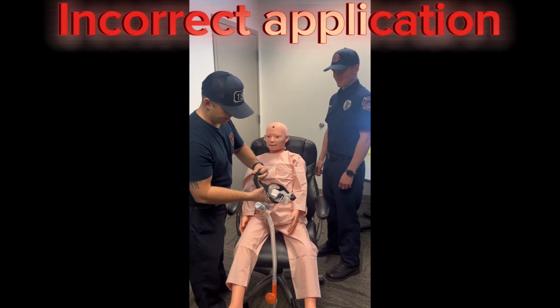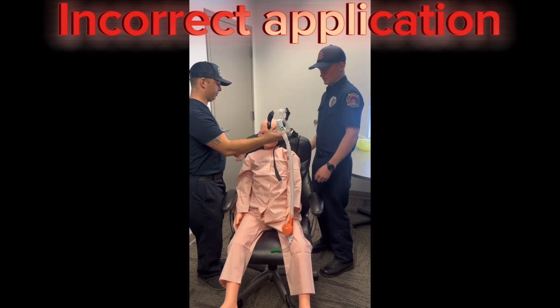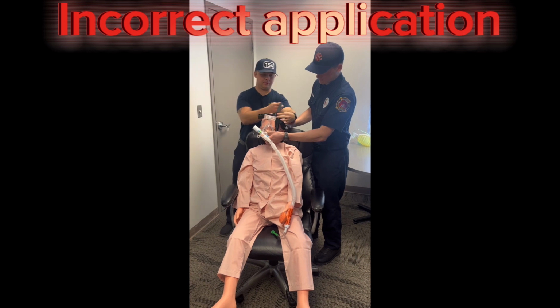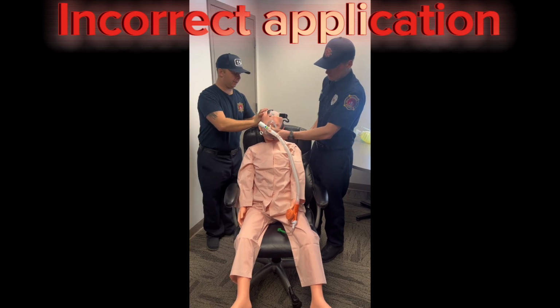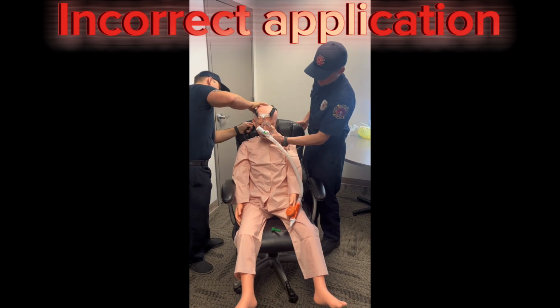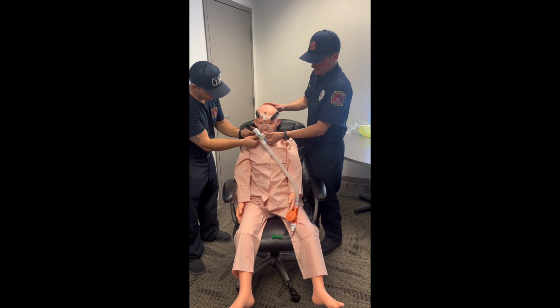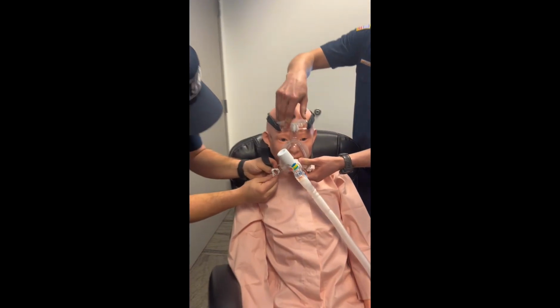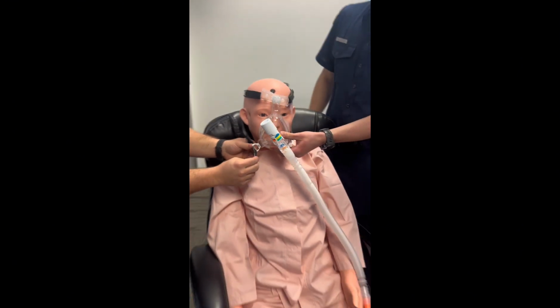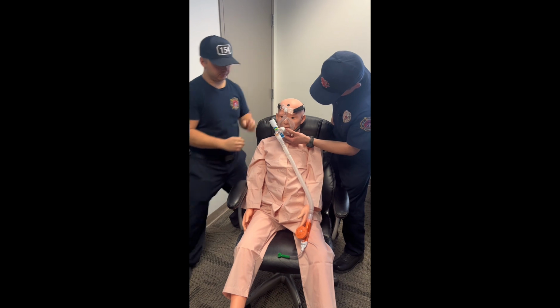We're first going to watch an incorrect application of the CPAP mask. To start with, the strap has been unthreaded from the white clip, which is going to make tightening the mask a lot more difficult. We don't have a good initial seal as it's over the eyeballs. There we go. Now it's over the face and mouth. But EJ now has to thread that through the white clip, which makes it just more time consuming and harder to get a quick, tight seal.